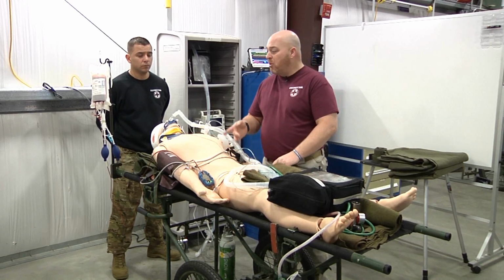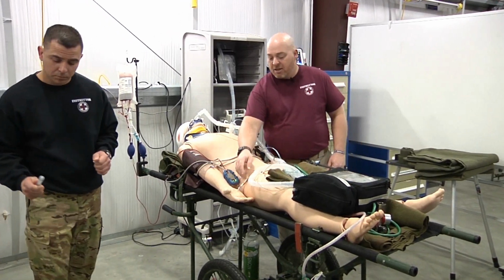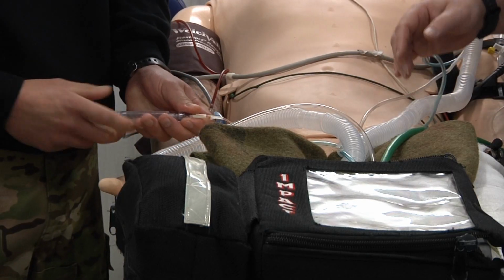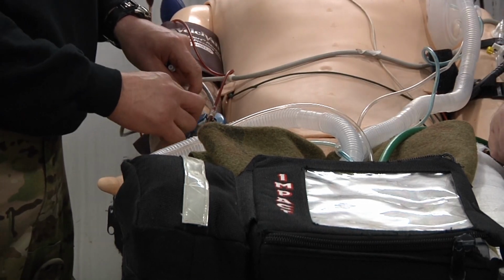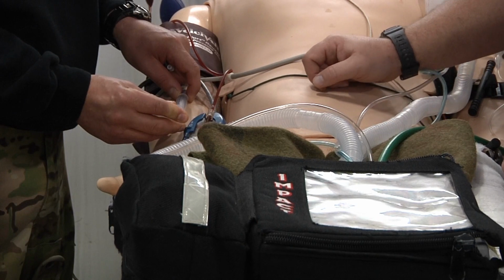Once you identify your 2 ports, you want to go ahead and flush those lines. Just take a normal saline flush. If you have blood running or anything like that, you don't need to disconnect the blood to flush it. You know that it's running if it's got something currently in there. Anything that doesn't have anything running, go ahead and flush those ports to make sure that they're not clotted off. If they are clotted off, it's a good opportunity to go ahead and pull that, DC that line and start a fresh line.